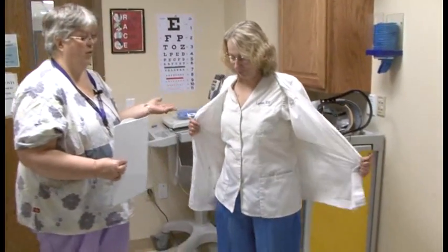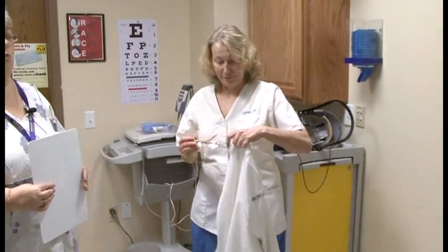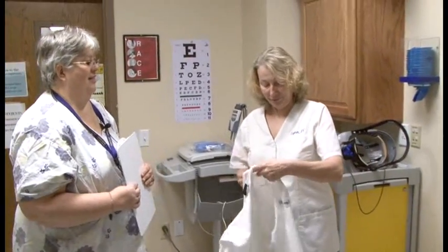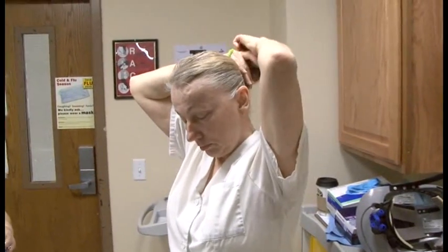We will be demonstrating donning and doffing biological PPE. Lynn is going to be the one donning. In preparation, Lynn has already changed into her disposable scrubs and removed all of her jewelry. She will also need to put up her hair so it can be contained. We've also asked Lynn to use the restroom and perform hand hygiene, because as you know, when you get donned up is usually when you have to go.